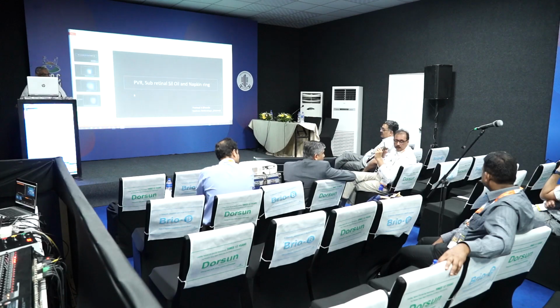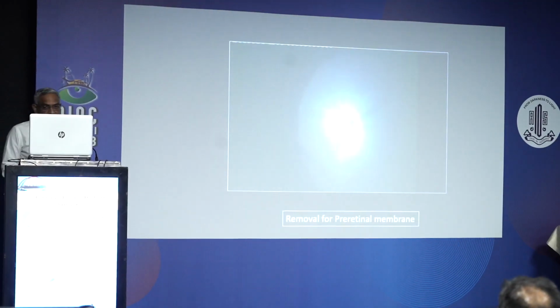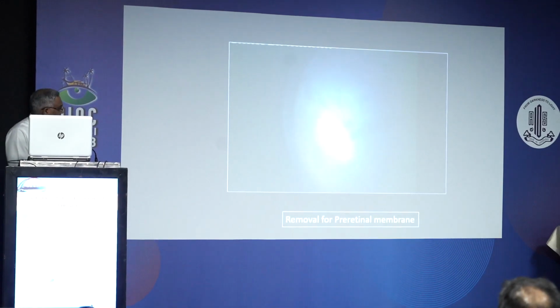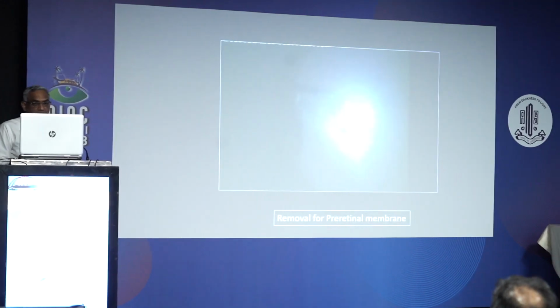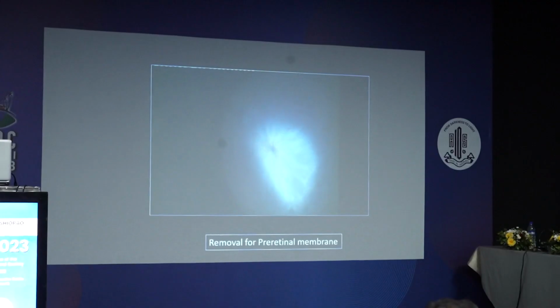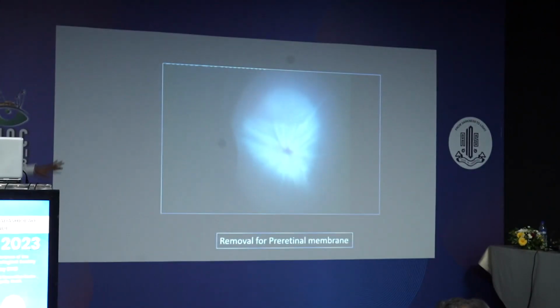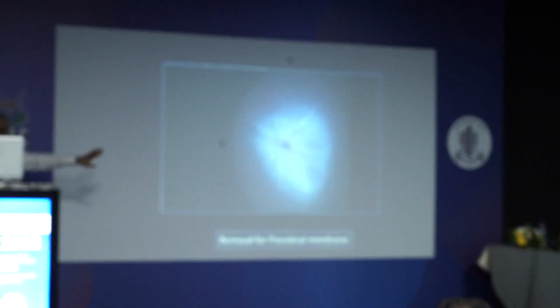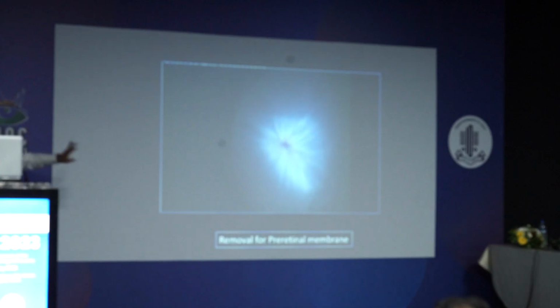If you can manage to make a large diameter. So what happened here? Radiating folds everywhere. Not scleral buckling; it was an RD and then had silicone oil inside, and this is after silicone oil removal. I did the silicone oil removal first on the table, and after removal, this was the picture on the table. The primary surgery was an encircling band, silicone oil injection, peripheral laser, everything.